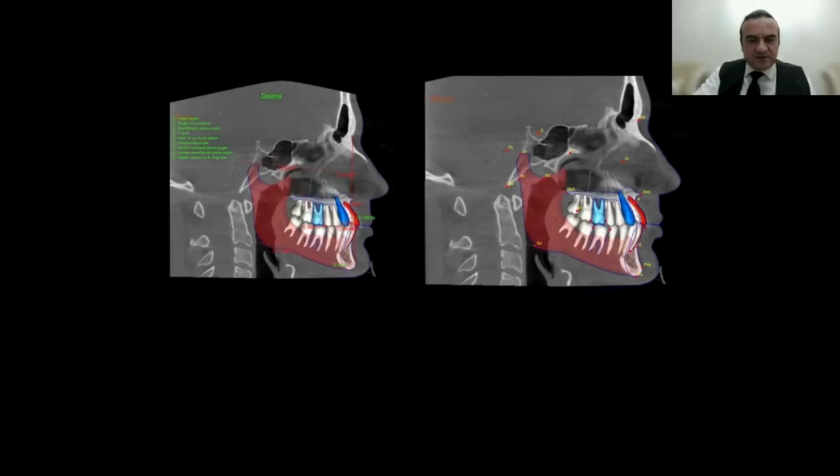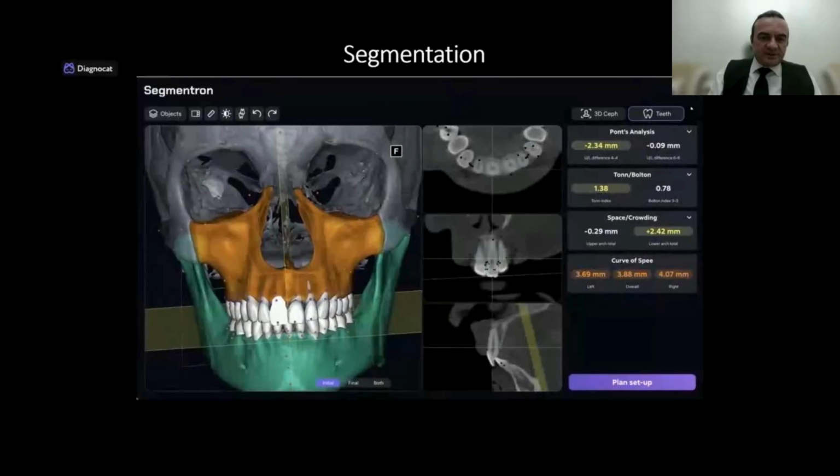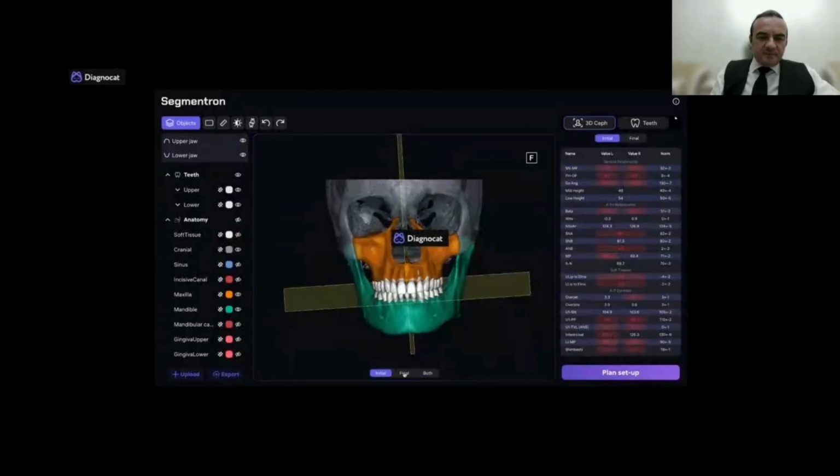We were making a fusion of the 3D representation of the teeth. Not only can we detect the anatomical landmarks, but we can do angular and linear measurements of the craniofacial structures as well. We can make the 3D ceph, and also do analysis of the teeth position as well.